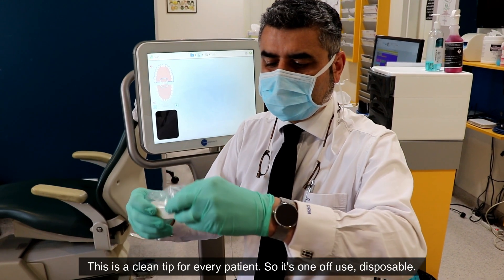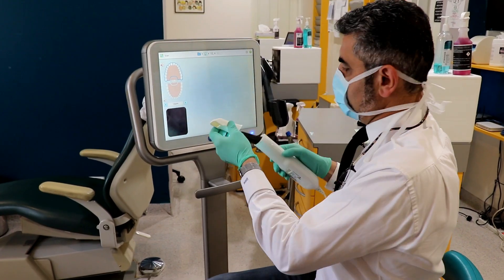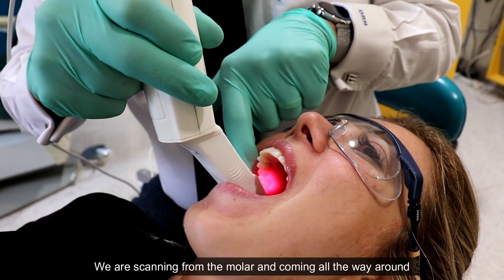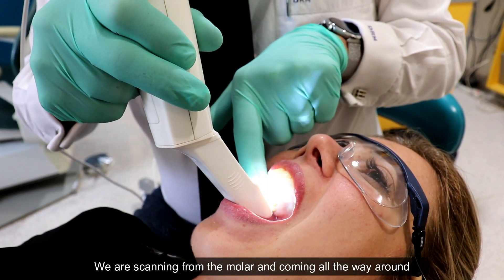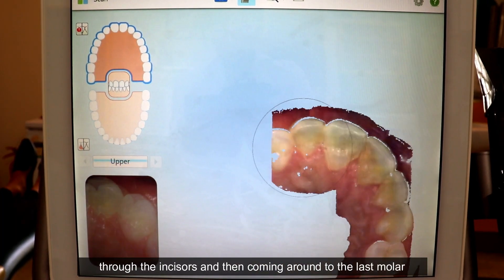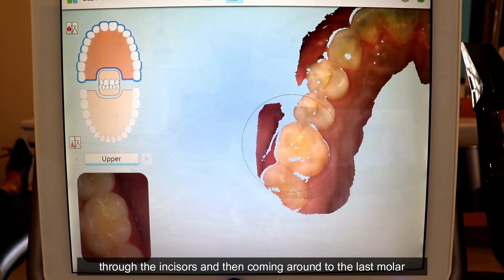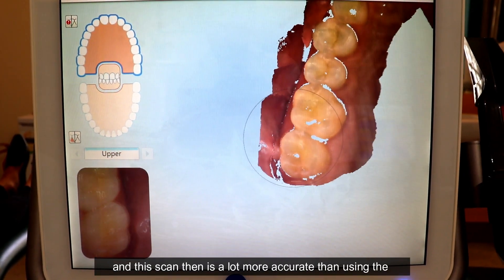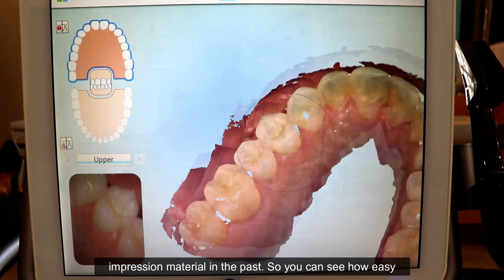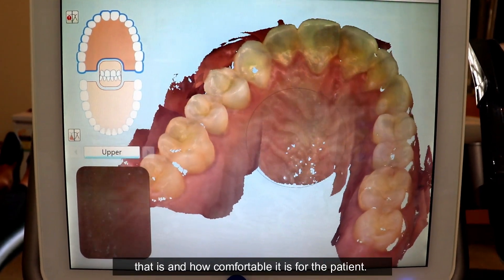We have a tip that goes on the end of the wand — this is a clean tip for every patient, so it's one-off use, disposable. We're scanning from the molar and coming all the way around through the incisors and then coming around to the last molar. This scan is a lot more accurate than using the impression material in the past. You can see how easy that is and how comfortable it is for the patient.